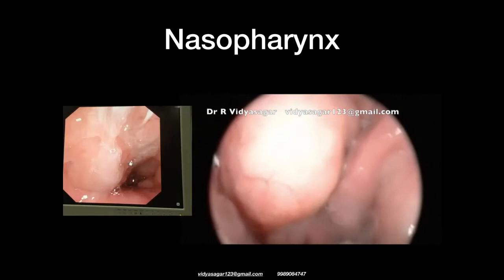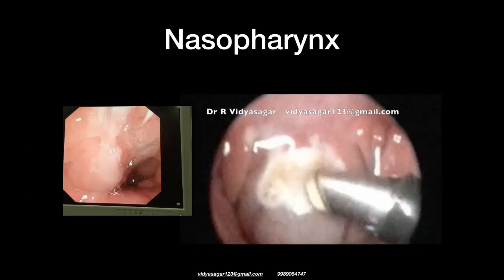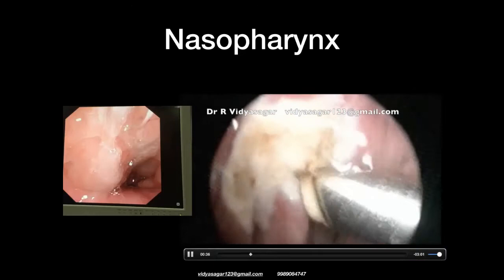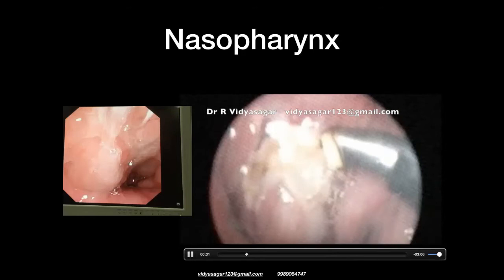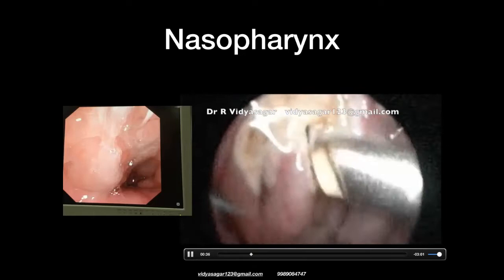This was an adult patient. After discussing the plan for marsupialization, we entered the cystic lesion, suctioned out all the infected material, decompressed the entire cystic lesion, and started to open it up.